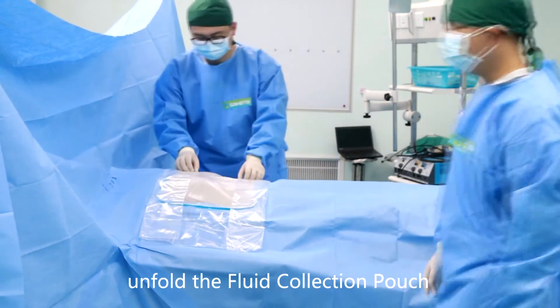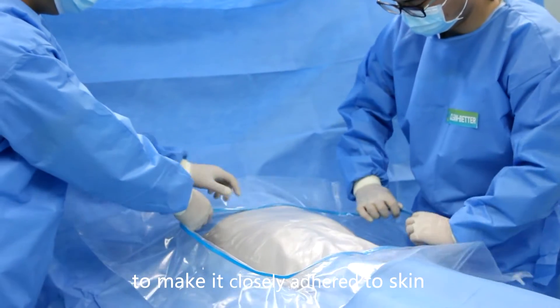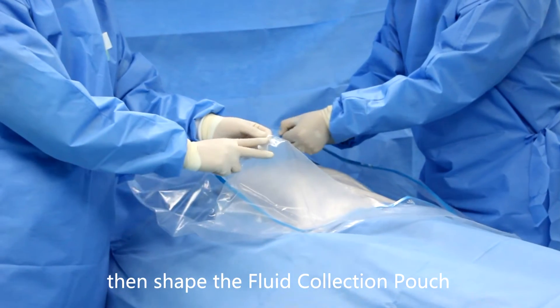Unfold the fluid collection pouch. Gently press the hose inside the drape to make it closely adhered to skin. Then shape the fluid collection pouch.